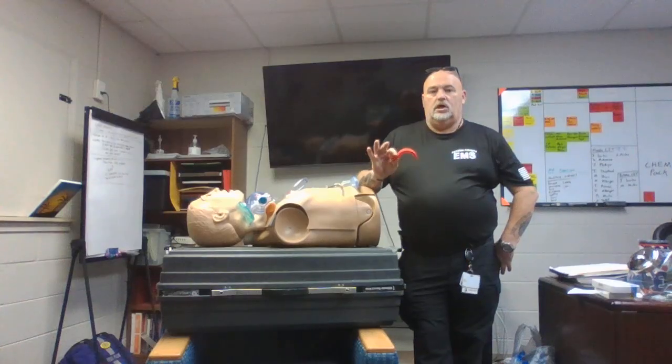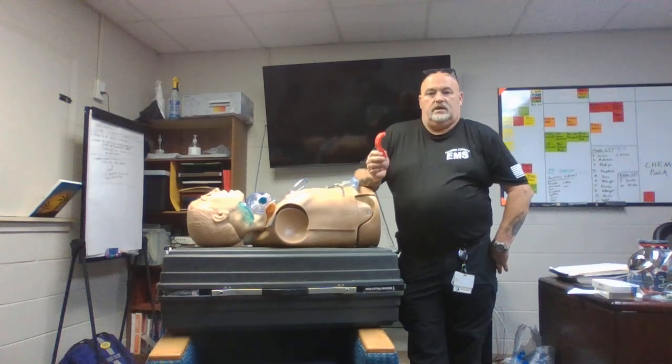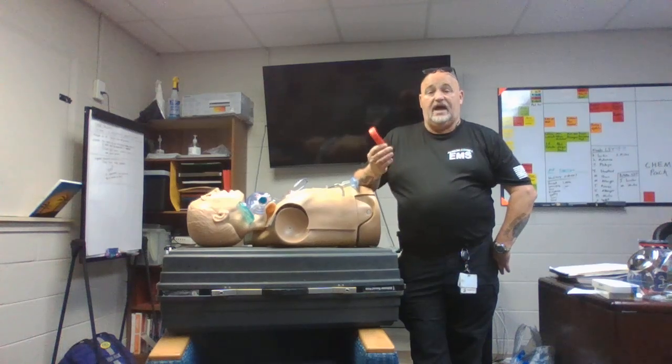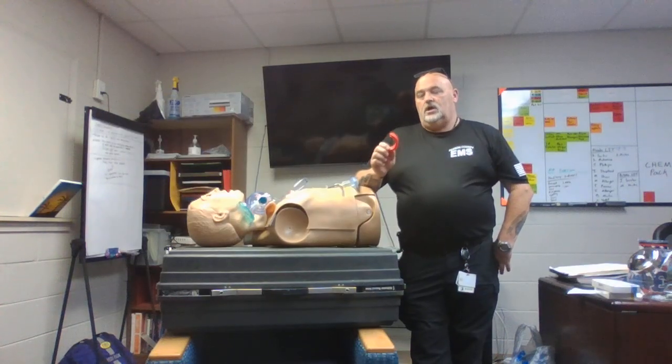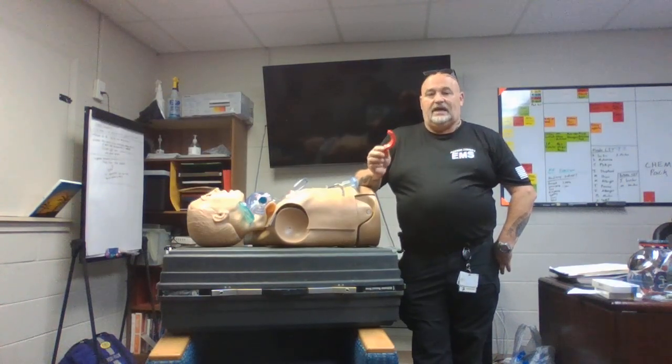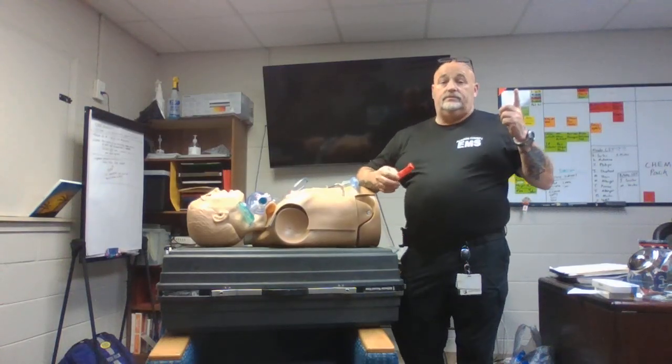Indications. Unresponsive. Apneic. Cardiac arrest or not. Unresponsive. Apneic. With these, though, we have to make sure of a couple things. They don't have an intact gag reflex. If you start to place this and the patient starts gagging, it comes out. Don't even attempt it anymore. Okay? Intact gag is one.